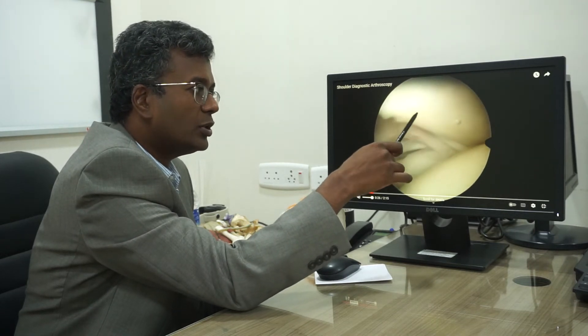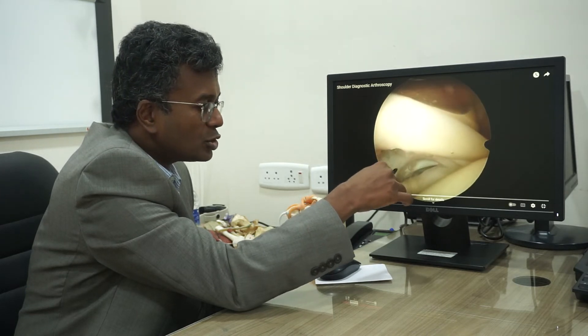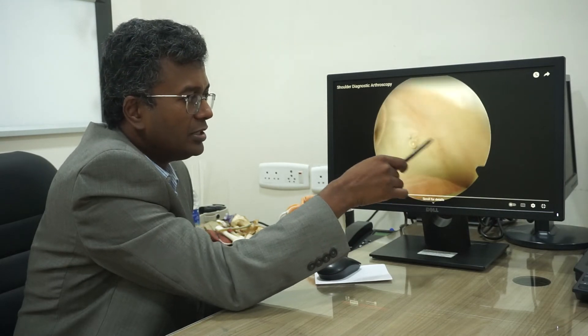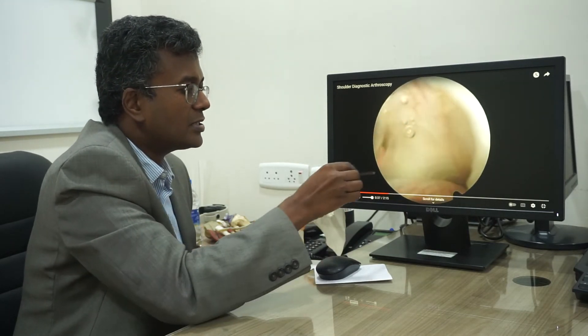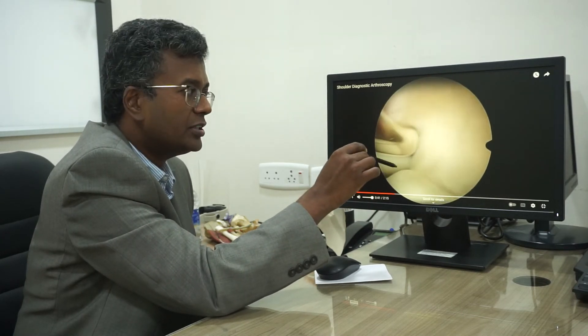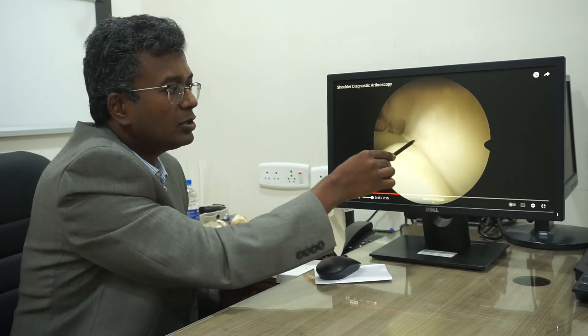We insert instruments through the portals. Coming around to this side, we see the cuff muscles. We also assess the biceps tendon for any damage, such as tendinopathy. This is the rotator cuff muscle attachment — we can see there is no significant tear, just some minor fraying.